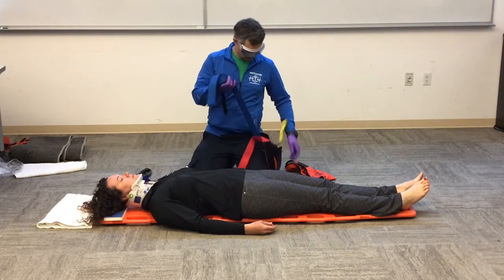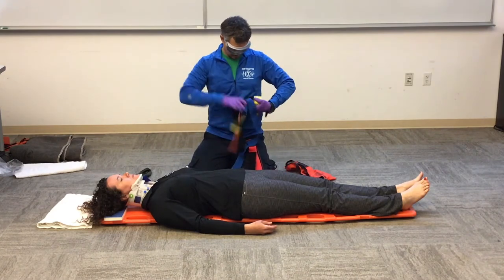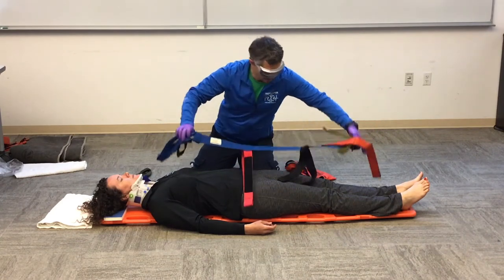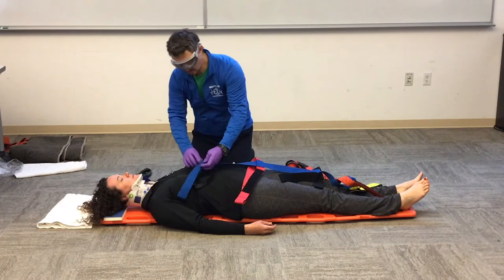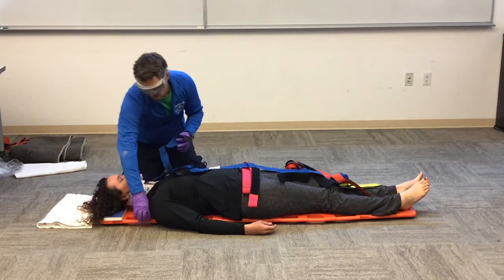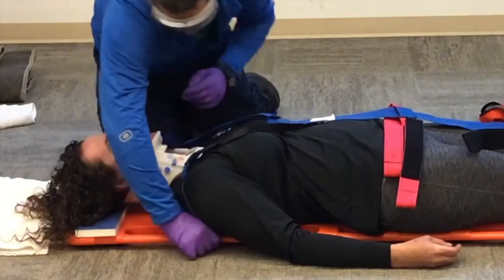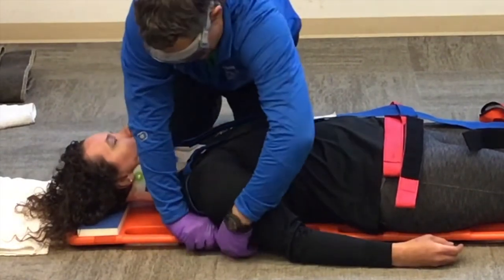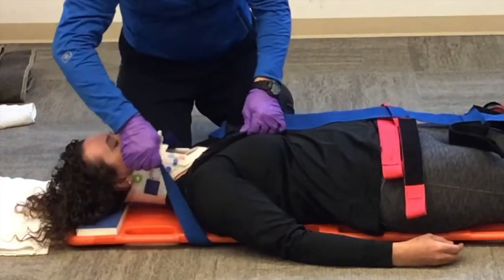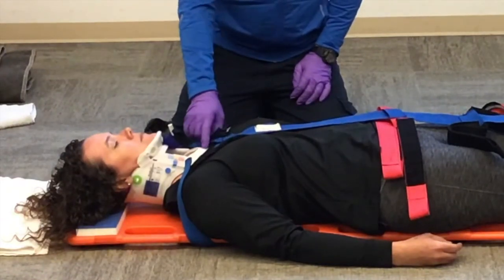First we're going to unroll our spider strap, lay it out on our patient, and secure the top Y. We want to go right below the patient's shoulder so it comes up and over the patient's shoulder. When we secure this, we want it on the sternum — we don't want it too high so it rests on our C collar.